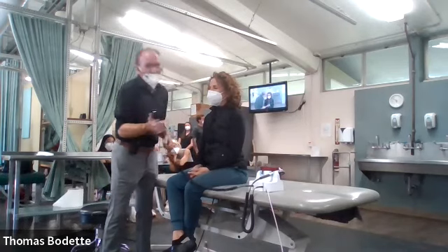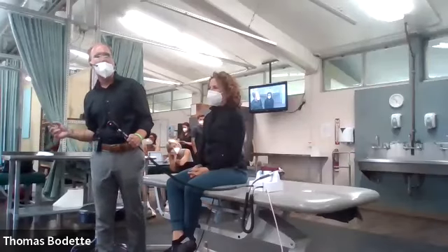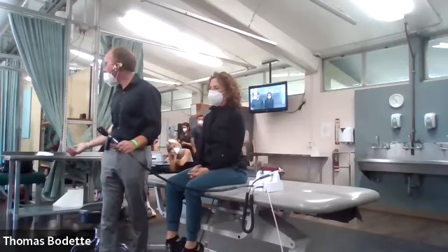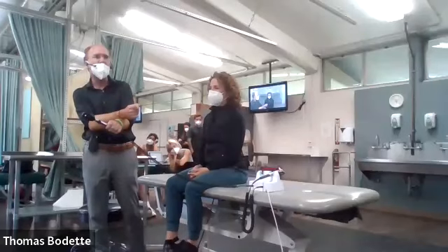So let's talk about the arteries and veins. They should be of normal consistency. There shouldn't be bursting blood vessels. There shouldn't be neovascularization, those small little blood vessels I showed. There shouldn't be cotton wool patches, things like that. And additionally, the artery and vein shouldn't be on top of one another, almost like it's discontinued.